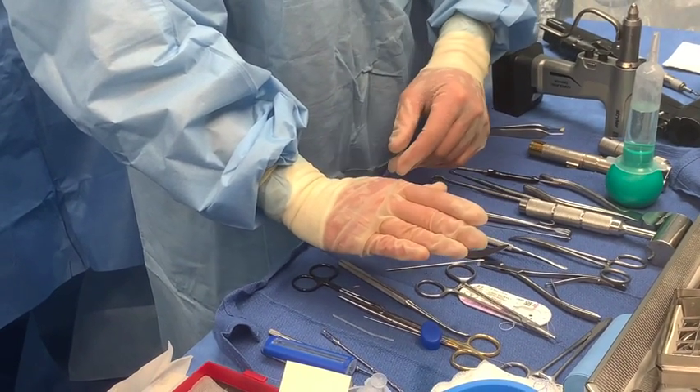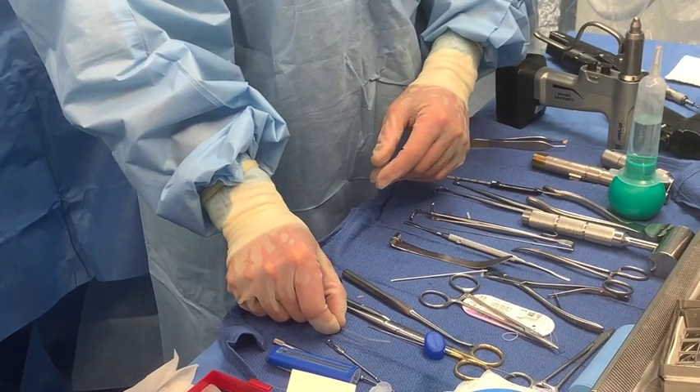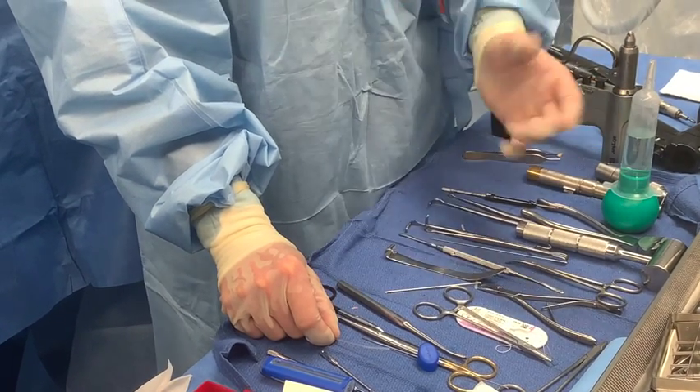Most people also don't want a really straight toe — they want to have a normal flexion. So this device is perfect, and again, it absorbs over about a year's time.